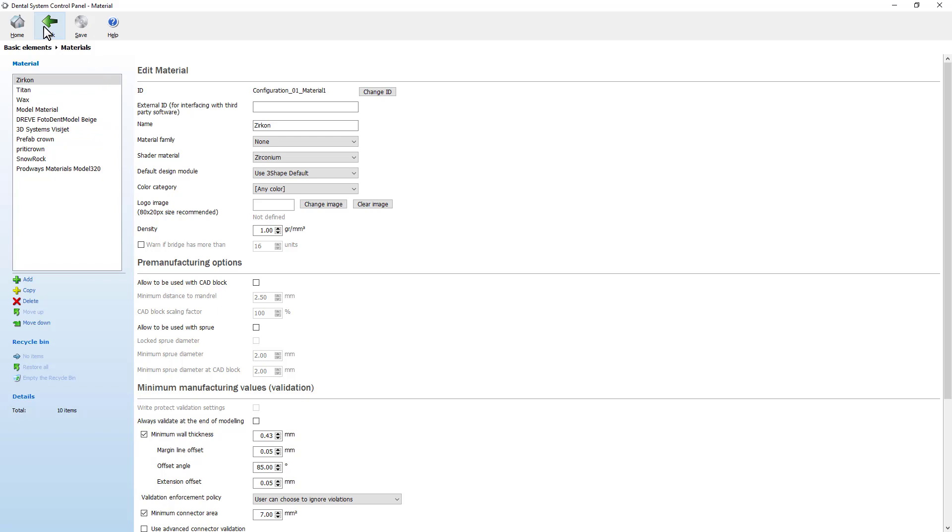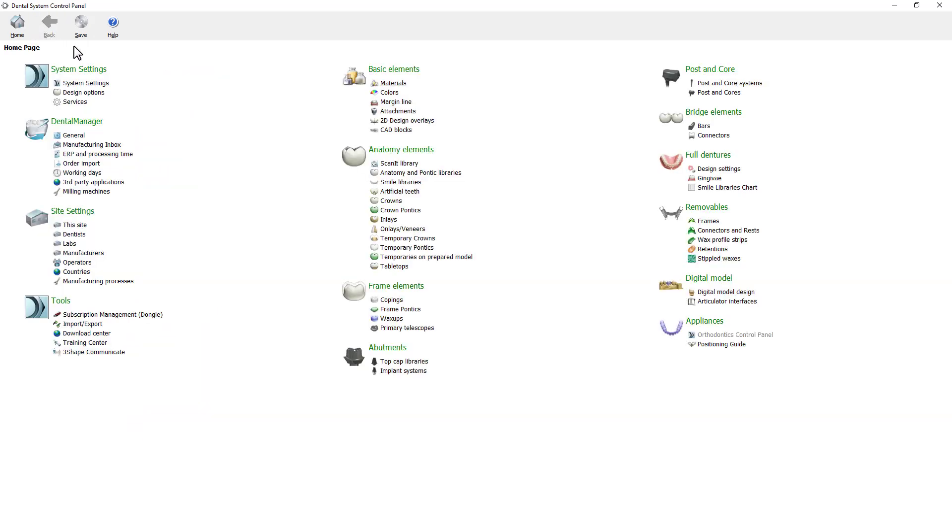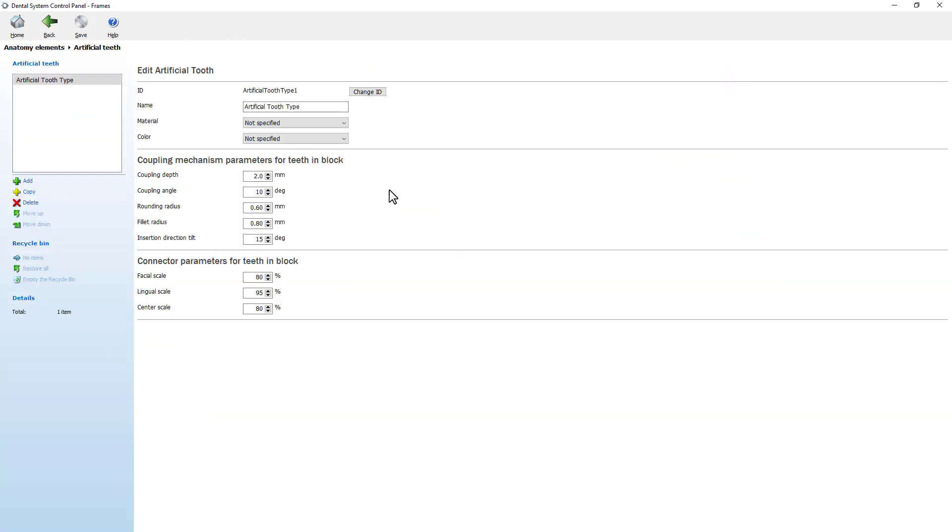Going back to the main control panel page, in the anatomy elements you'll have a new artificial teeth page. This page lets you edit an artificial tooth. Set the coupling mechanism parameters for teeth in blocks.